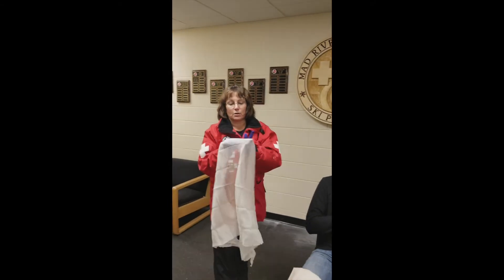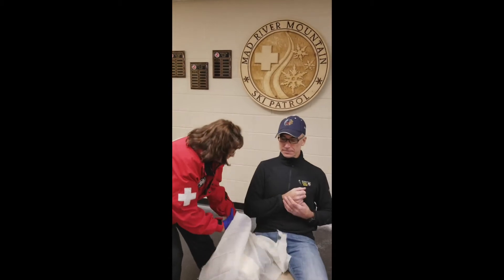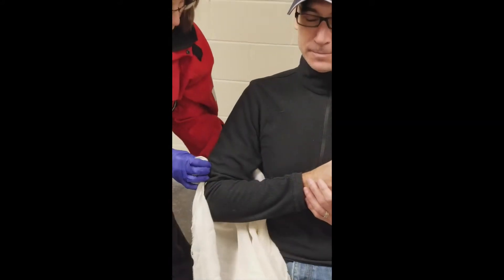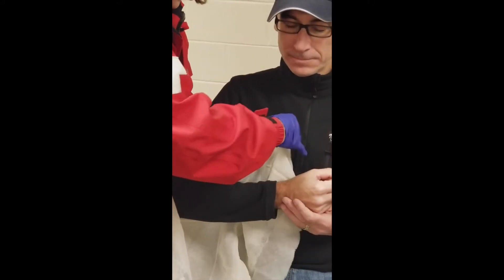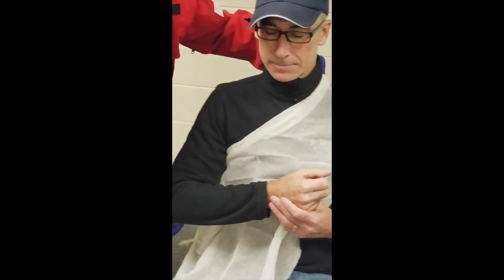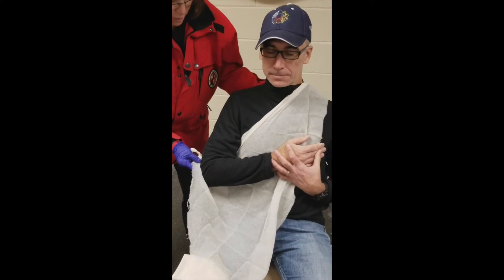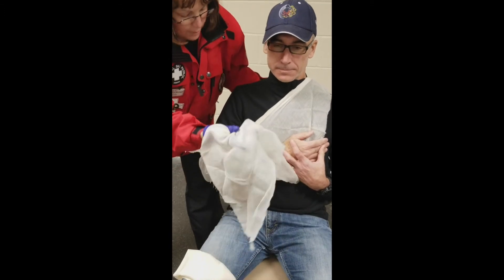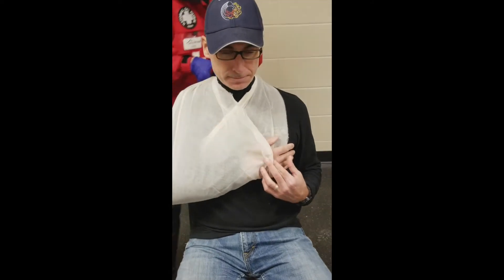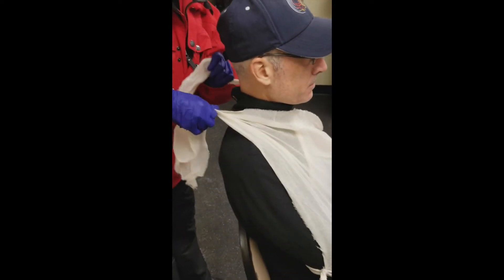The first thing we're going to do is take the apex with the little knot tied in it and snug it right up to the elbow area. Then you're going to take this part of it and bring it up over the opposite shoulder. You're going to cradle the arm like a hammock and bring it up over here, straighten it out, raise the hand up a bit, and make it snug.